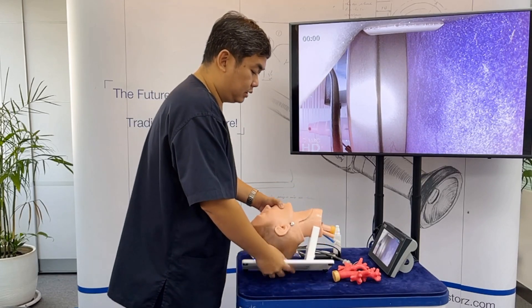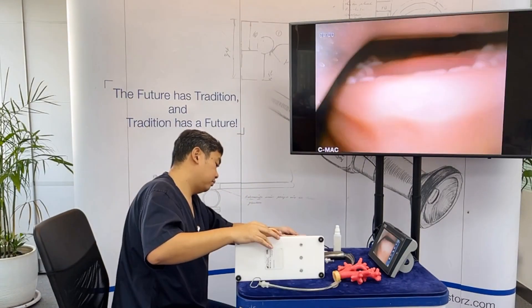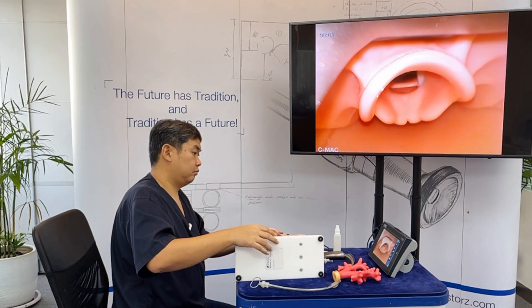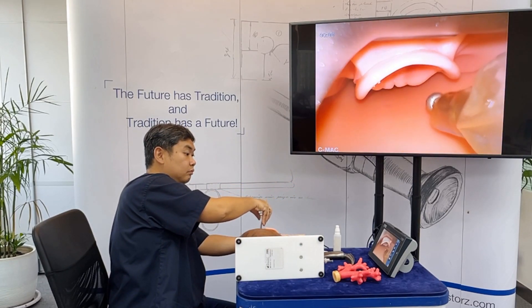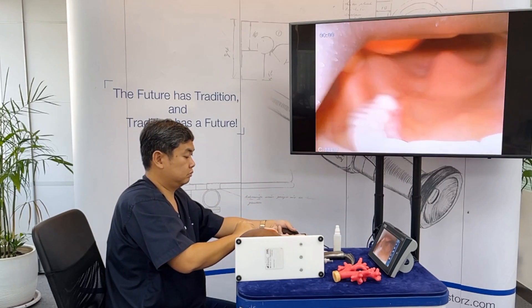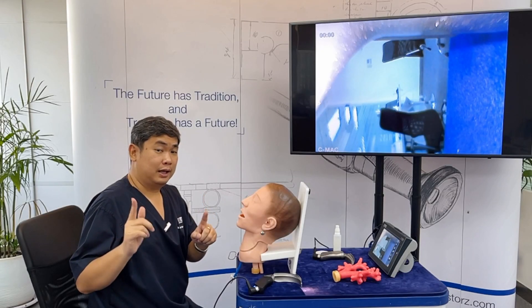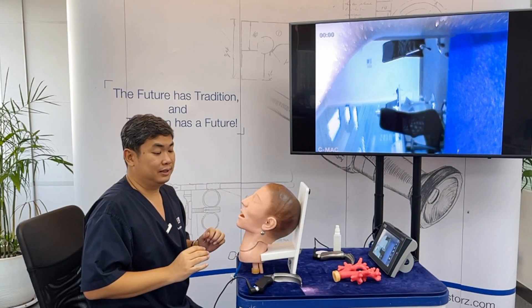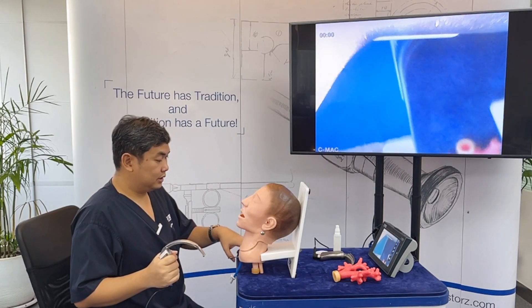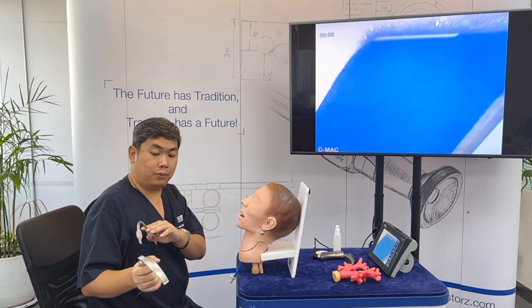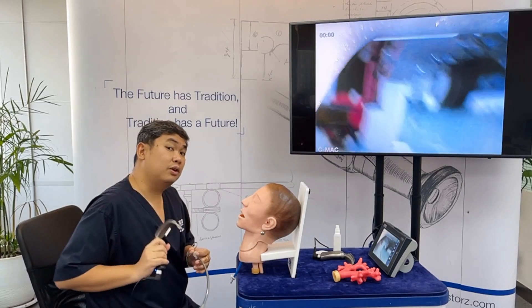Let's start with the lateral position. Then try intubation while the patient is sitting down. Tell your participant to hold the video laryngoscope in their right hand and the ET tube in their left hand. An easy technique is to position the video laryngoscope first, then slide the ET tube along the flange of the video laryngoscope.